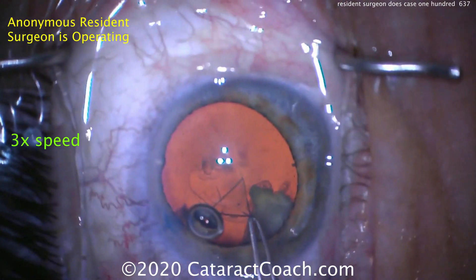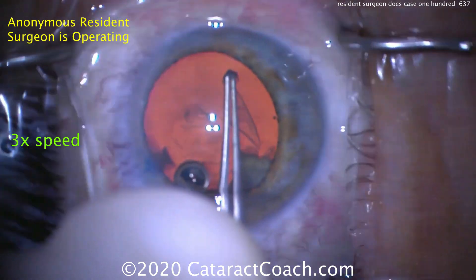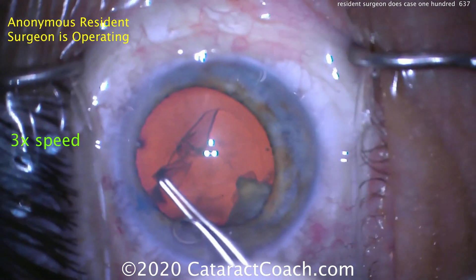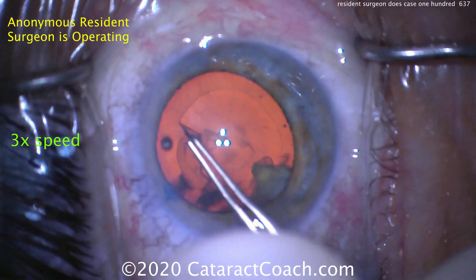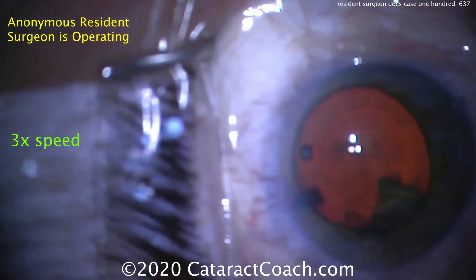We're showing the video at three times speed because the unedited video is about 25 minutes. I know my viewers, especially the young ones, can't sit through that. So we've cut this down to about eight minutes going at high speed, and I think you can watch that for sure. That's a darn good looking capsulorexis.